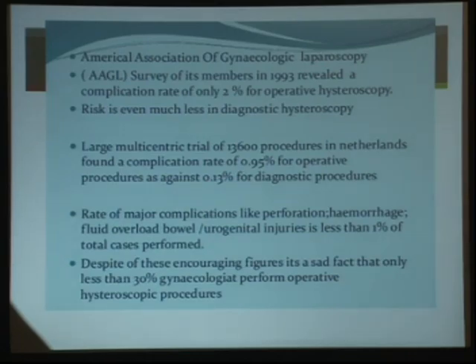According to the survey guidelines, the complication rates with diagnostic hysteroscopy are very low. A survey in 1993 revealed a complication rate of only about 2% for operative hysteroscopy. The risk is much less in diagnostic hysteroscopy. Large multicentric studies have revealed a complication rate of 0.95% for operative procedures as against only 0.13% for diagnostic procedures. The rate of major complications like perforation, hemorrhage, fluid overload and injuries is usually less than 1% of the total cases performed.